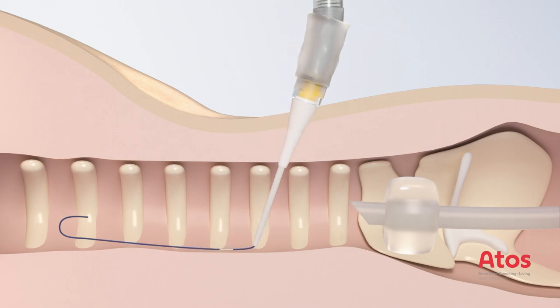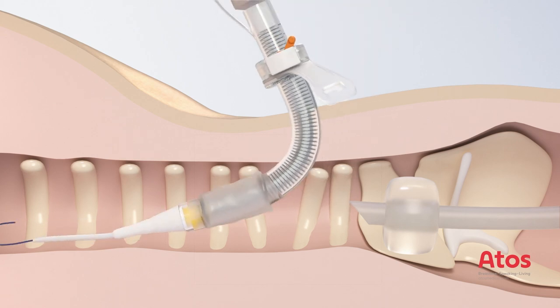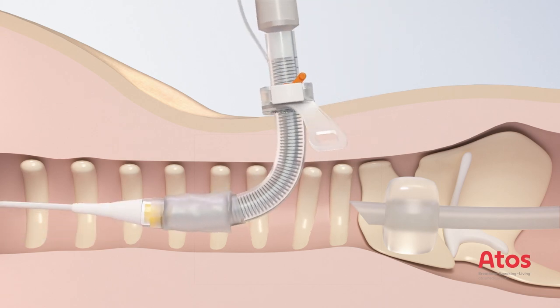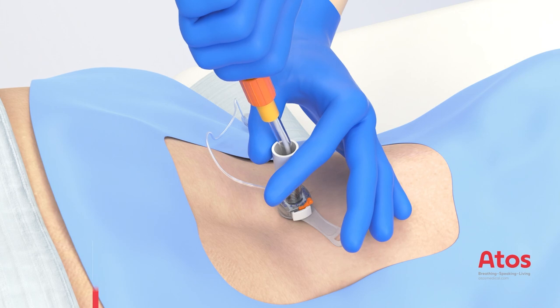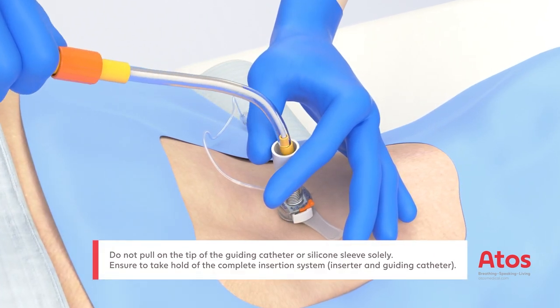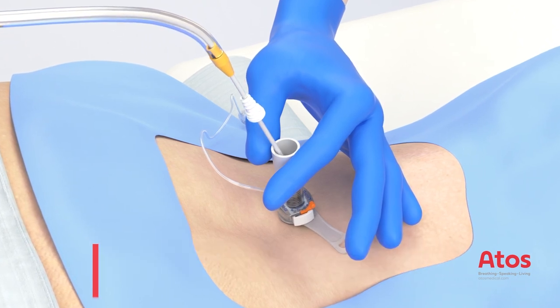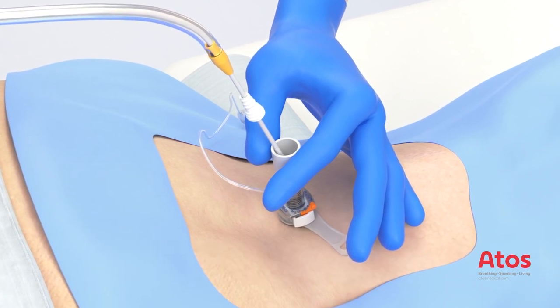Start the insertion vertically and place the tube in a controlled movement until the neck flange reaches skin level. Hold the 15mm connector — not the adjustable neck flange, as this is adjustable — with two fingers and remove the inserter, guiding catheter, and Seldinger guide wire.